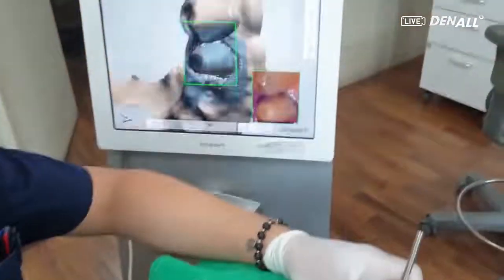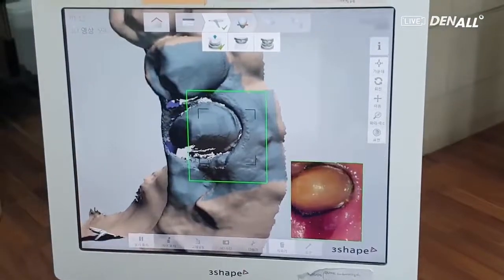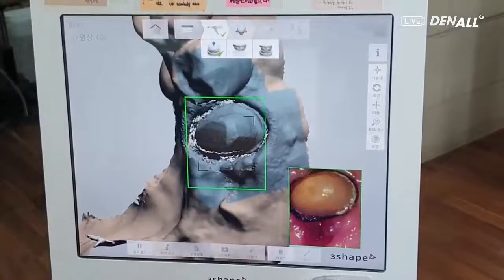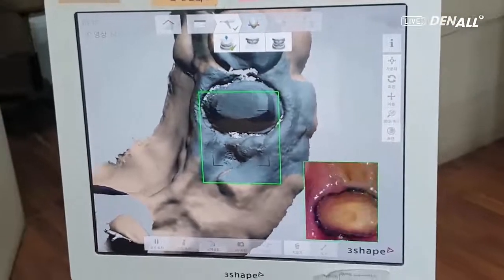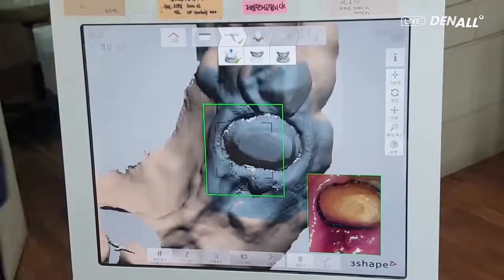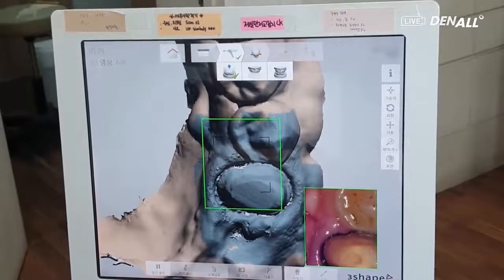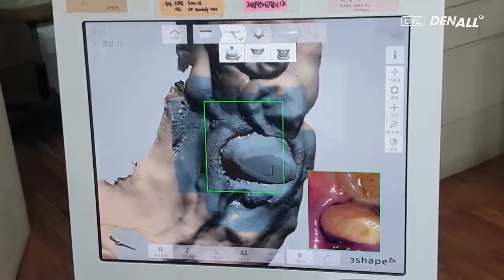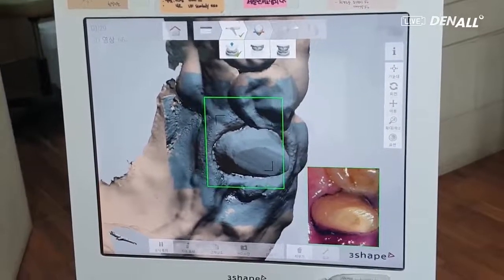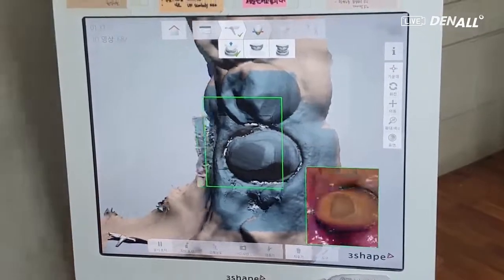This is a full arch mandible that is scanned. The abutment margin and the entire shape will be scanned more precisely using high-resolution mode. The margin is exposed clearly with gingival cord. The contact point and abutment are prepared for precise scan data.